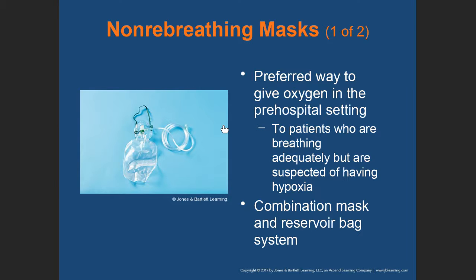And if your patient is having a panic attack, don't just fling a partial rebreather on the patient. You're going to have to coach the patient, right? Don't just throw the device on the patient. You're going to have to communicate with the patient. Sir, you're going to have to control your breathing. No, I can't. Yes, you can. You can control it. I can't. Yes, we're going to do it together. You're going to work with me. I can't. Yes, we can do it.